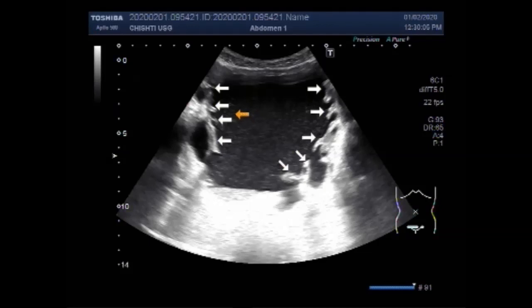These are the multiple trabeculi — this is trabeculation of the urinary bladder.